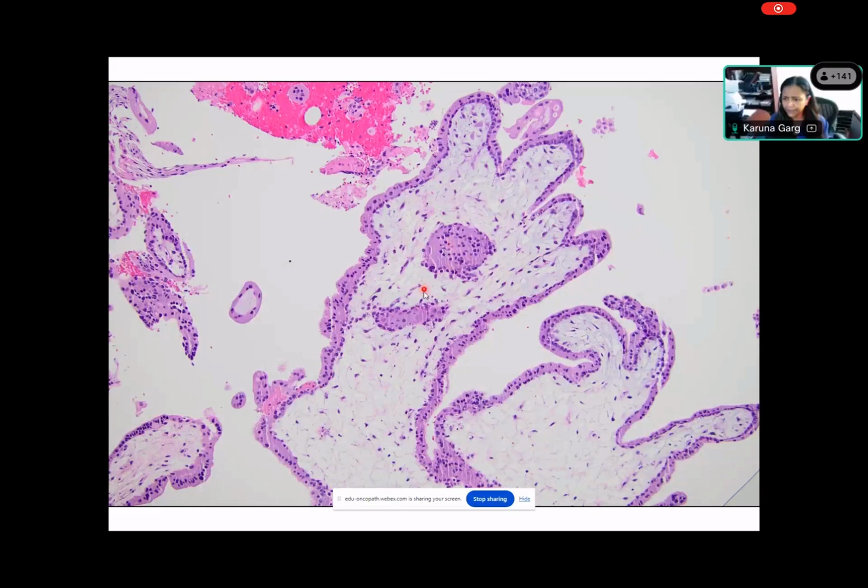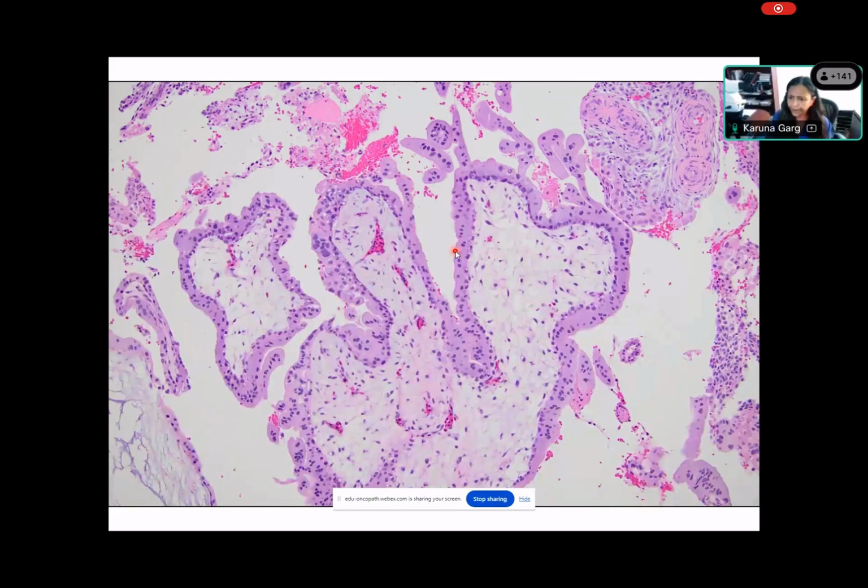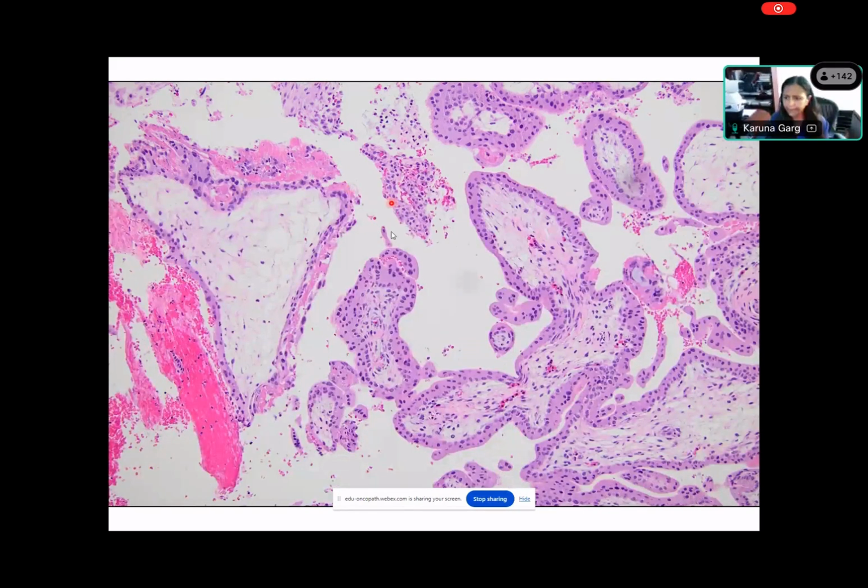You see trophoblastic inclusions, often multiple, often large. And again, you can see trophoblastic proliferation around these villi as well. It's just not going to be as dramatic as a complete mole. And then again, you see the nucleated red blood cells and you know you're probably not dealing with a complete mole. Another example with trophoblastic proliferation, irregular contours, and nucleated red blood cells.